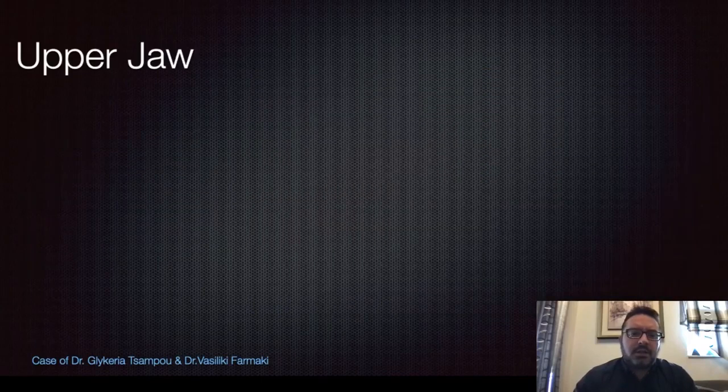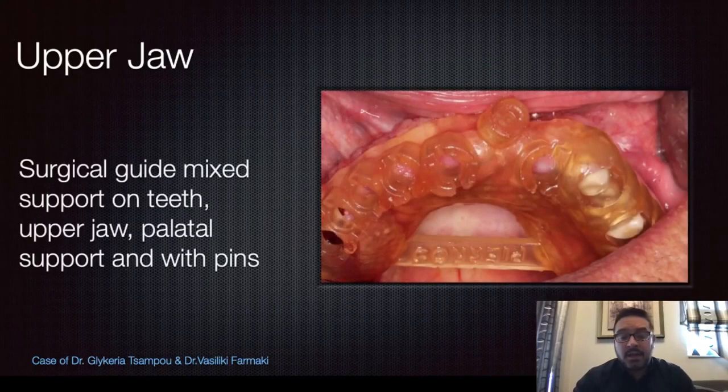And as you can see, this is the surgical guide. Because of the complexity of the case, it was teeth supported, as you can see. It was pin supported. There is one pin in the front and one pin, if I remember correctly, in the distal of the guide position. We have palatal support and also a bar in the middle to keep it more easily in its position.